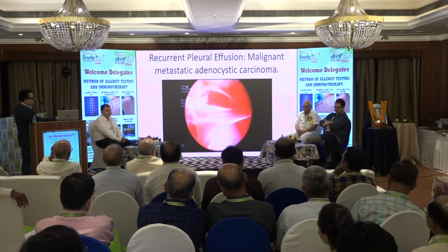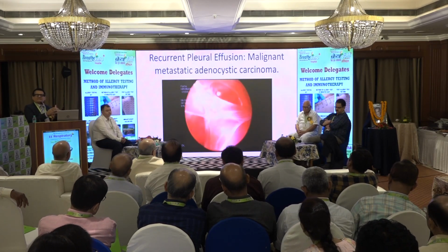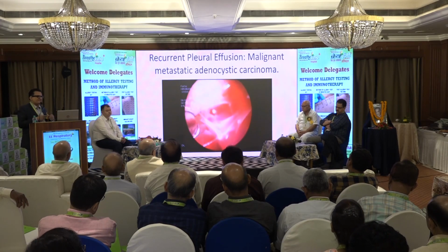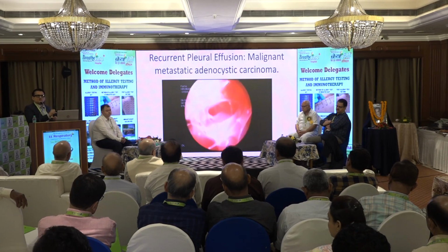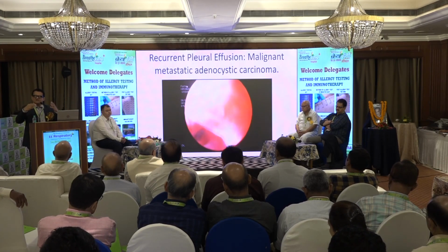So look at this. This is a pleuroscopy which is being done. You see the intercostal drainage tube here. Multiple tappings lead to a lot of adhesions, so some adhesiolysis has to be done. You have to break the adhesions, and after breaking the adhesions, we find that yes, there is a tumor there. We take the biopsies there, send them for testing, and because we are able to remove all the adhesions, the lung is expanding.